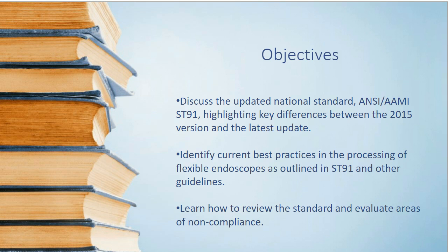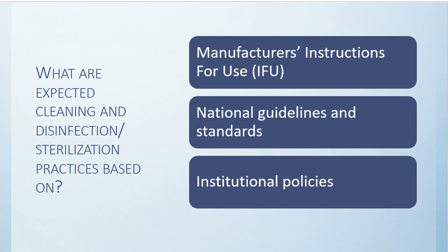Next slide. So what are expected cleaning and disinfection and sterilization practices based on? Well, they should be based on manufacturer's instructions for use, or IFUs, standards and guidelines, and your own written policies. So which organizations do you follow? Which organizations should you follow?